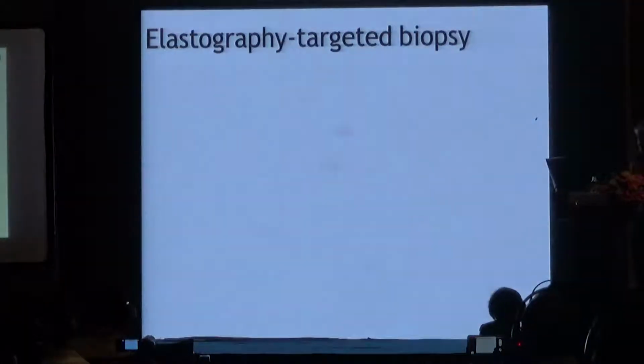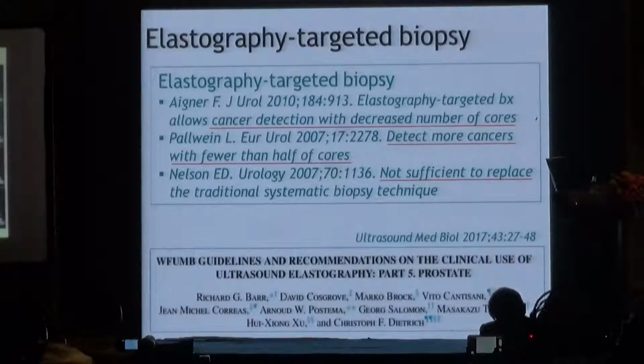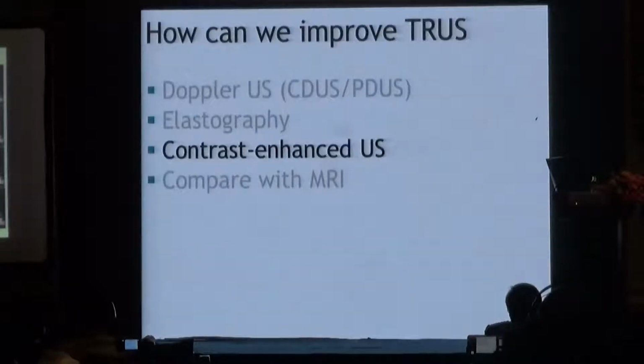There were papers regarding elastography targeted biopsies, and most of them said that it is quite helpful in biopsy site selection. And there was the World Federation guideline of using elastography for prostate. This is the guideline paper, published in Ultrasound in Medicine and Biology, the official journal of the World Federation of Ultrasound.